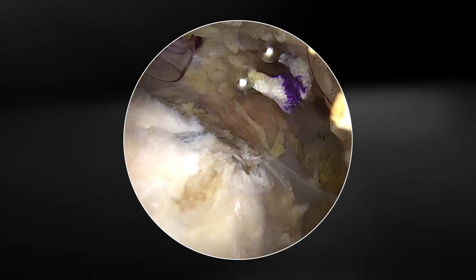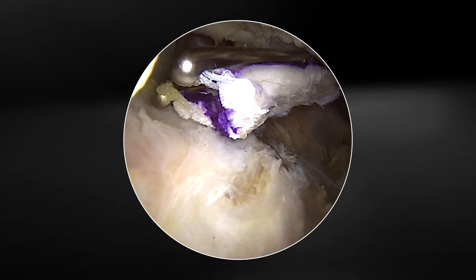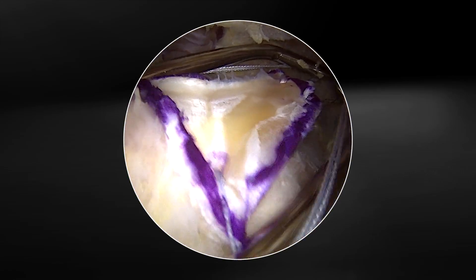Once it's inside the shoulder, we're going to bring it directly into the top and center it upon the place that we want to be. We can then open the graft and set it exactly where we want the graft to go.